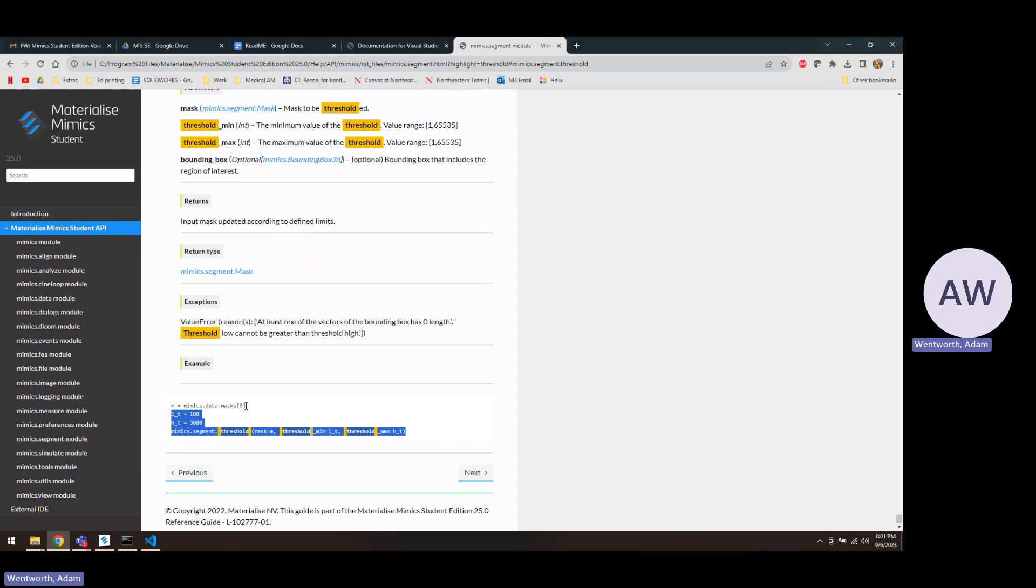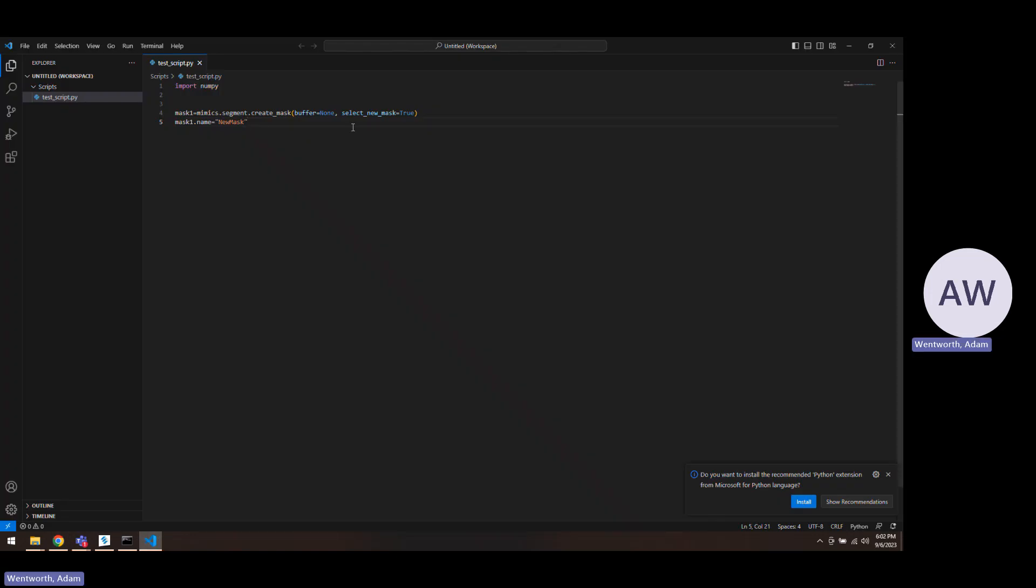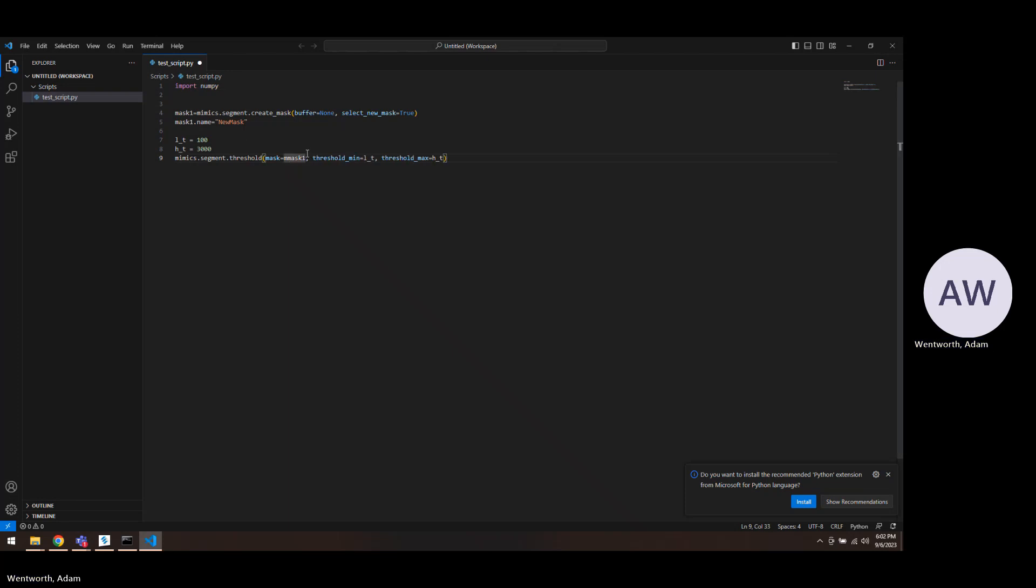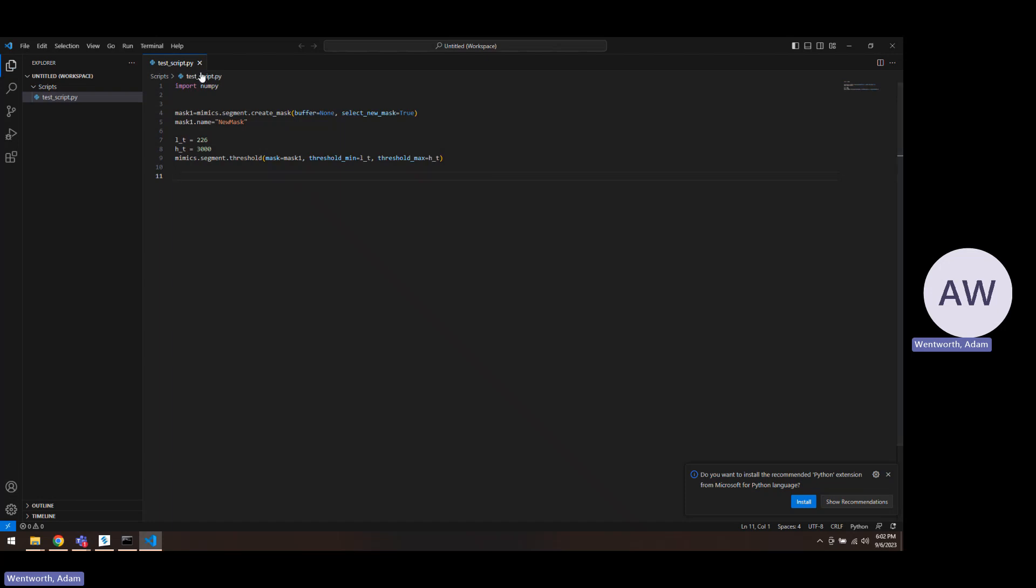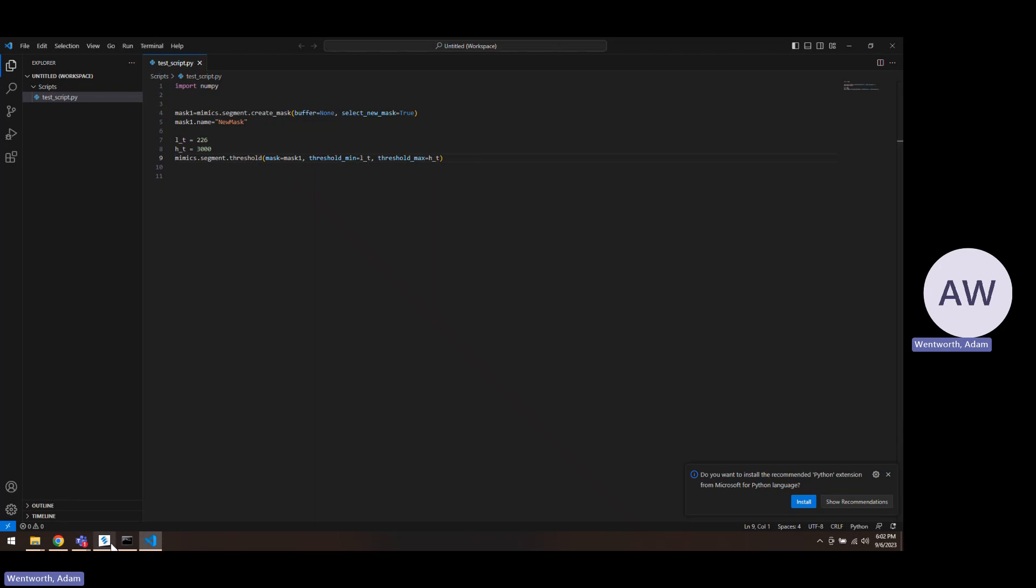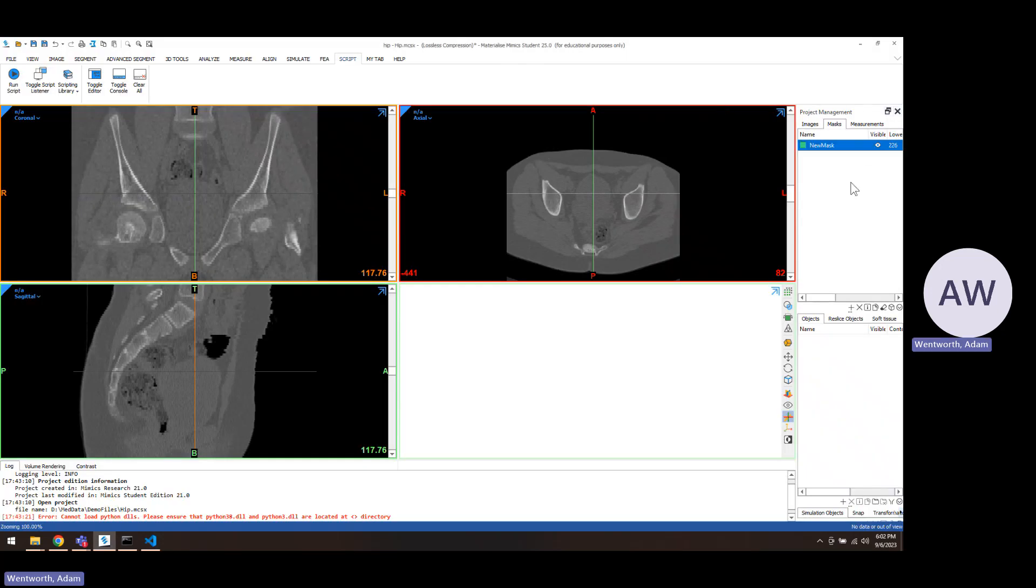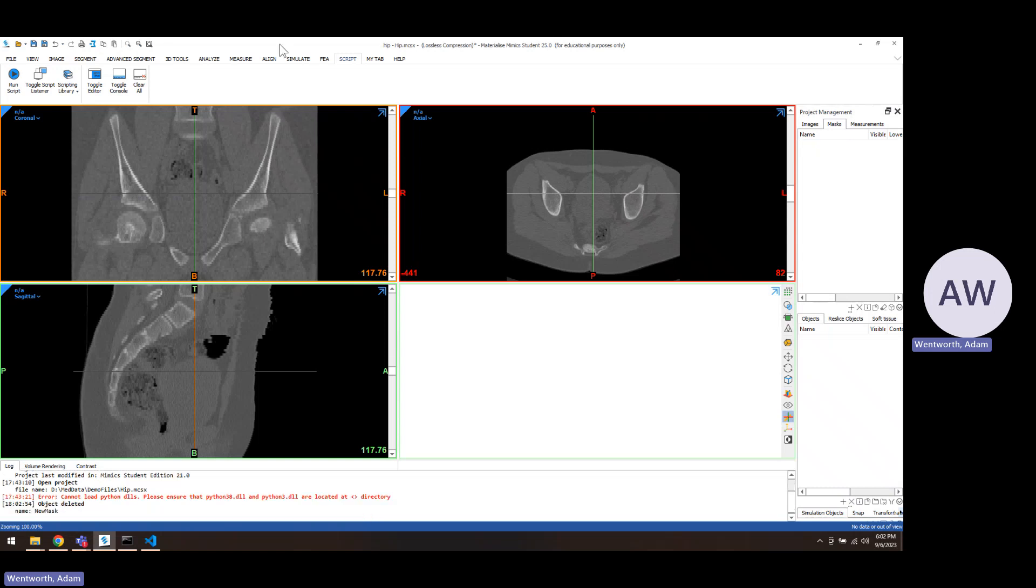We'll paste that. This would threshold using the mask that we created, so we could put mask in there. The threshold would be from 100 to 3000, but I know bone is usually 226 as the low value for that. When you need to save this, just hit ctrl+s. Anytime you make some new code or make some edits, you'll see this little circle pop up here. When you hit ctrl+s to save it, that'll go away. If you need to comment out code, you can use a hashtag symbol and it'll show up. Let's run this one more time and we'll see if it actually does that thresholding step.